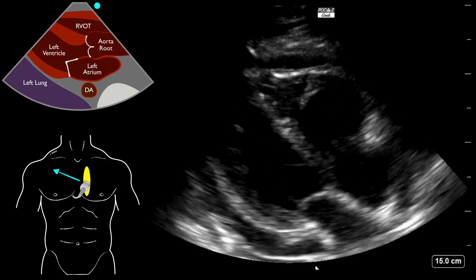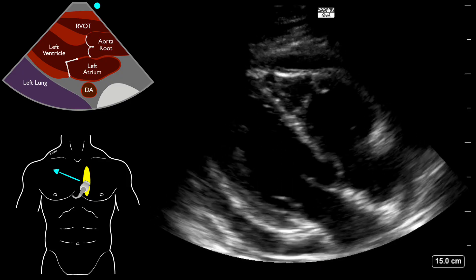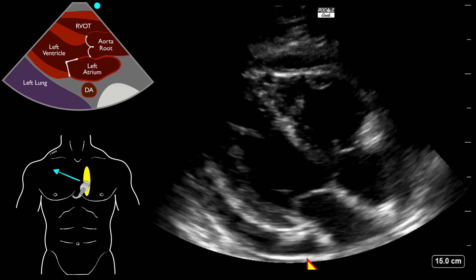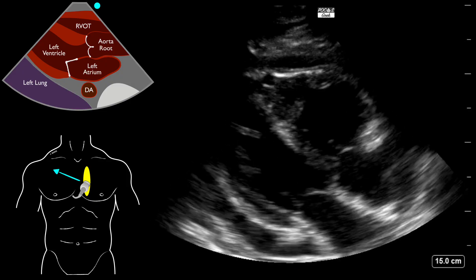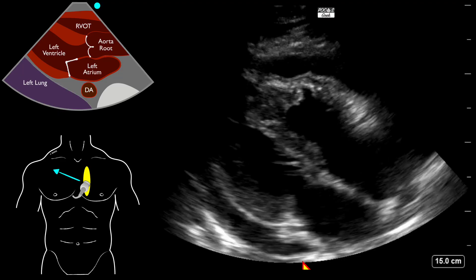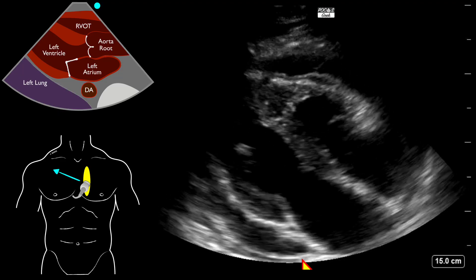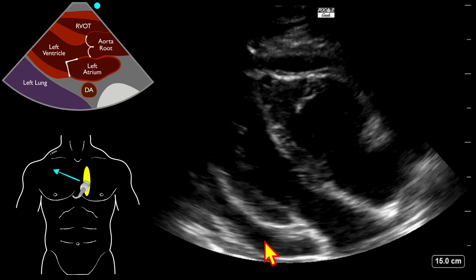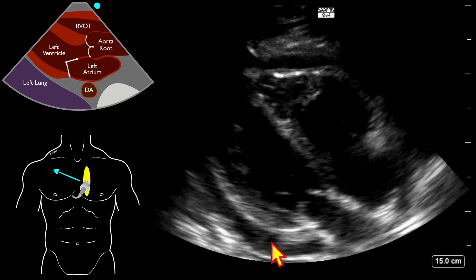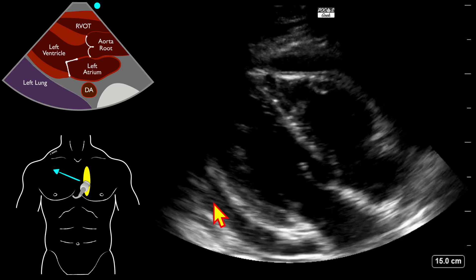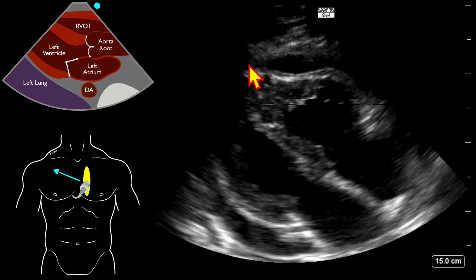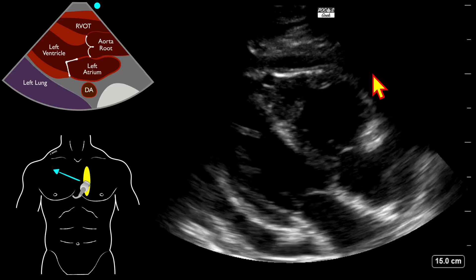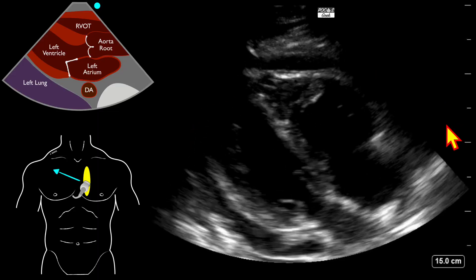We don't see the descending aorta. It would be nice if they had increased their depth at the bottom of the screen. But we can see a pericardial effusion along the left ventricle, and it does appear to be circumferential.